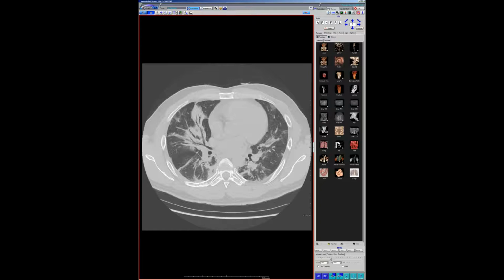Are you seeing, like one thing we talked about, if you see what looks like your classic community-acquired infection in an older person, say a lobar area of consolidation with a pleural effusion, are you seeing those on the radiographs at the acute presentation? No, I've not seen those in any COVID patients. As a matter of fact, I don't think I've seen pleural effusions in COVID patients. So if you've got a single lobar pneumonia or something like dense pneumonia, I don't think I would bring up COVID.